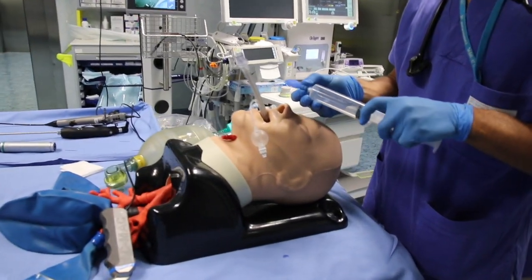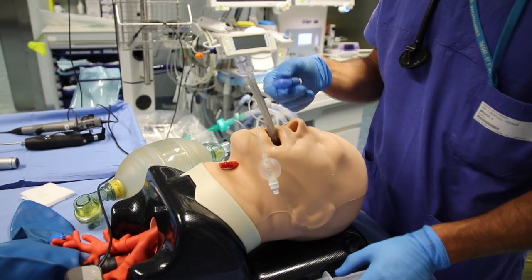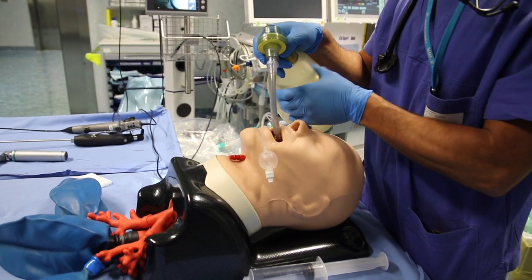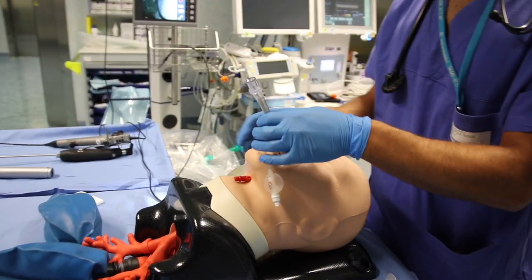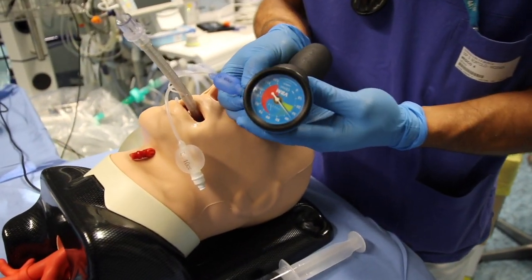Proceed with re-inflating the proximal cuff, this time with less volume of air since it is now in the trachea, and resume ventilating the patient. An important step is to check the tracheal pressure of the proximal cuff with a pressure gauge.